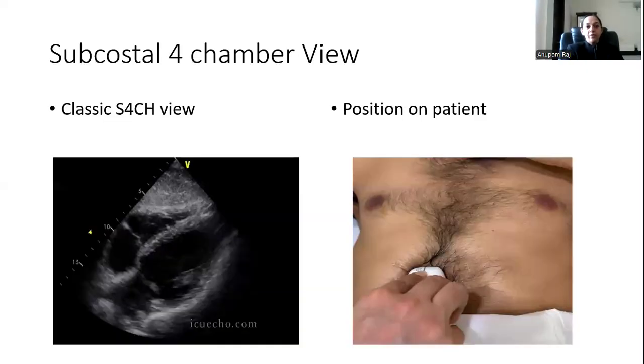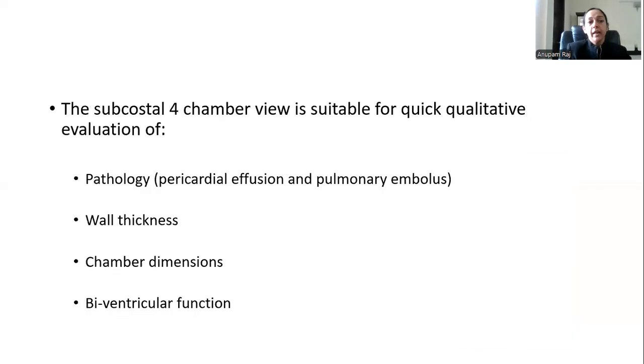subcostal four-chamber view. Now, this is the picture of a classic subcostal four-chamber view that we're going to achieve. And this is the position in which the patient is usually lying, supine.